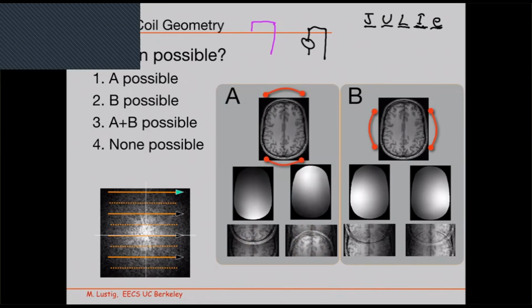But in this other case, there is some variation, but it's just multiplied by some value, so it's kind of the same as the other one. It's just darker, but the aliasing looks exactly the same. You know what I mean? Because we undersample in this direction, and the coil sensitivities don't vary much here, mostly varying left to right, I'm going to have a hard time. This is going to be way more ill-conditioned than the other case. So we can possibly recover it by a factor of 2 from A, but not from B.